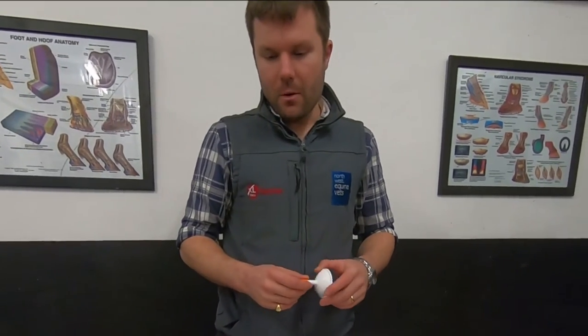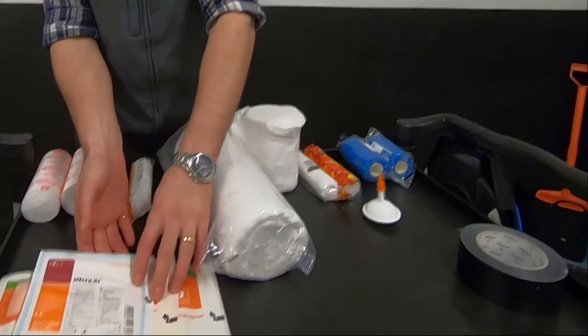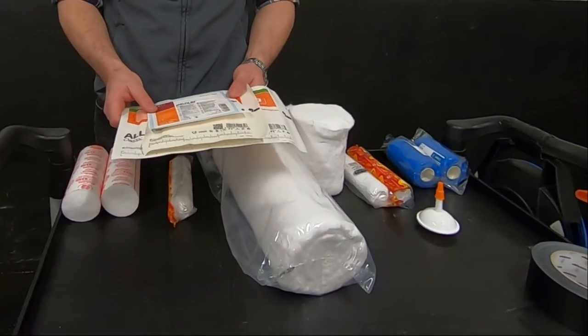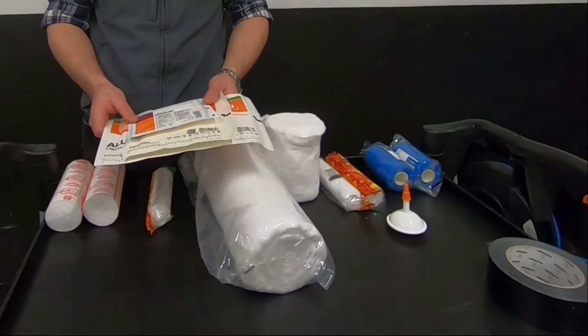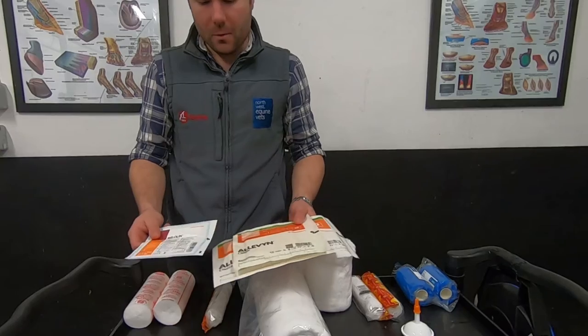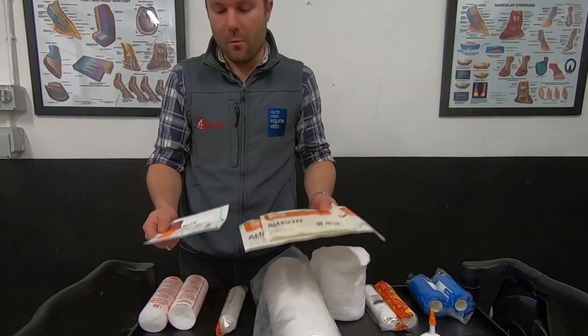Assuming your horse has a wound, and that's the reason why we're applying a bandage, first of all you're going to need some dressing materials. There are various sizes and types of dressing material, but they all work on the same broad principle, in as much as they are not designed to stick to any blood or discharge from the wound. The two types we have here are Melalin and Alevin. Both are non-adherent — they won't stick to the leg.